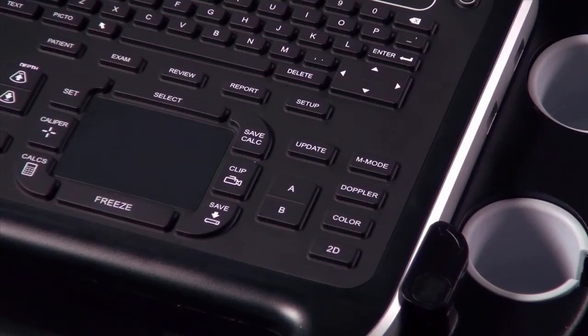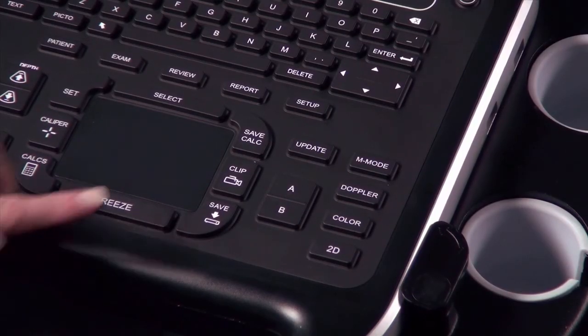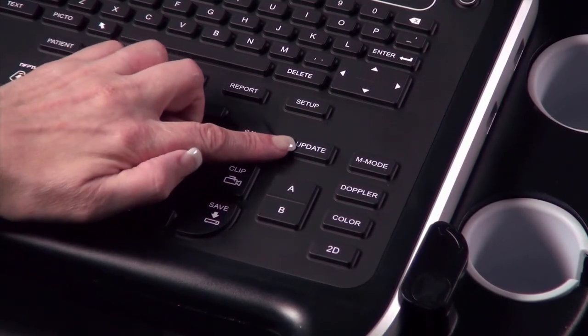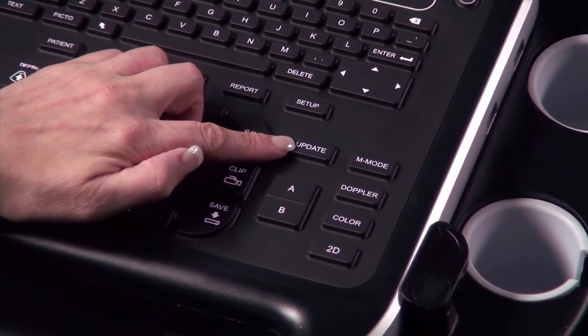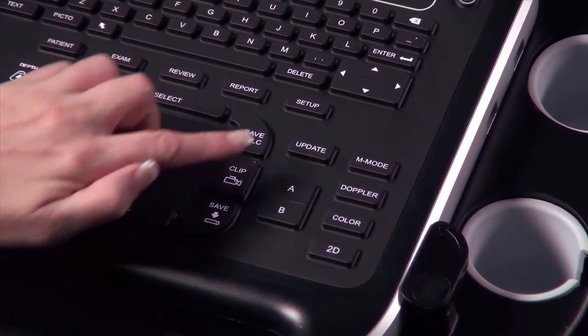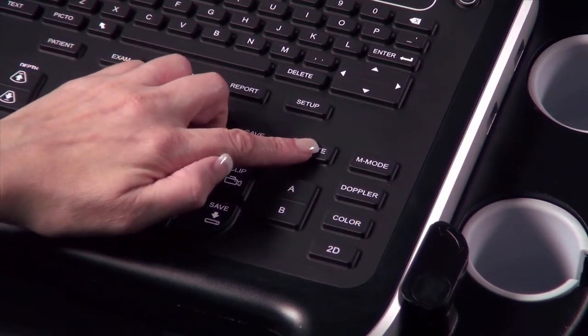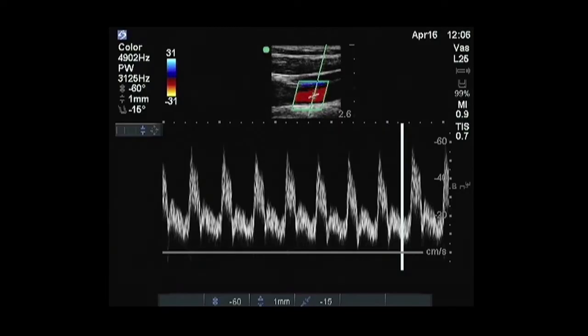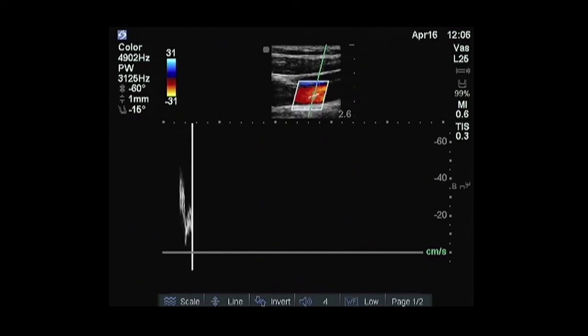Above the A and B keys is the update key. This allows you to toggle between dual and duplex screens and image modes in M mode and Doppler.